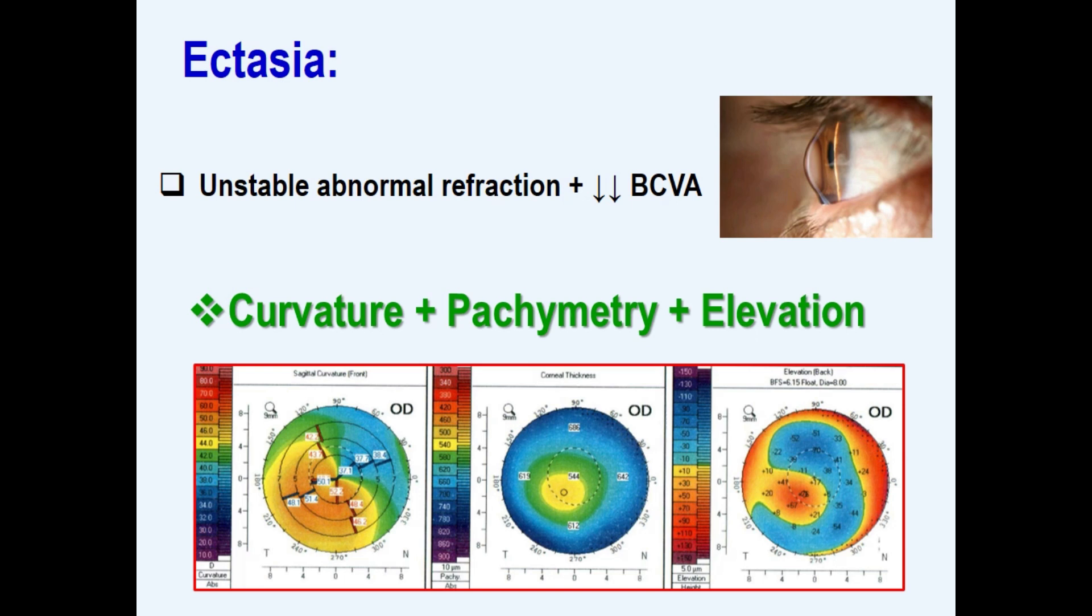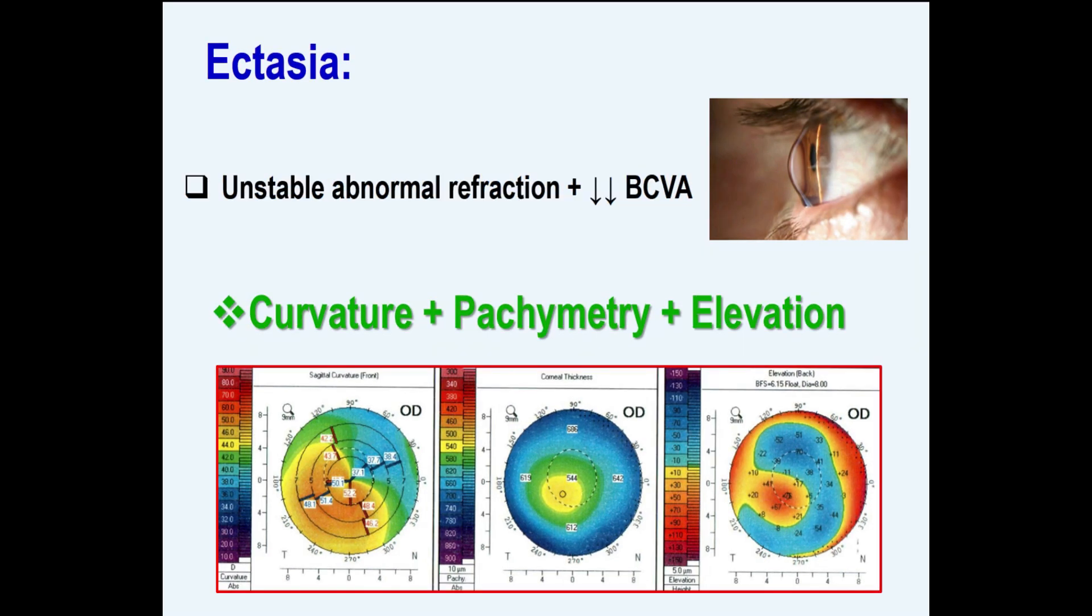Elevation maps are considered the cornerstone in detection of corneal ectasia. Anyhow, in well-established ectasia such as keratoconus, the three maps—the curvature, the pachymetry, and the elevation—are abnormal. The three zones—the steep curvature, the thin pachymetry, and the abnormal back elevation—are corresponding. This is called three-point touch.